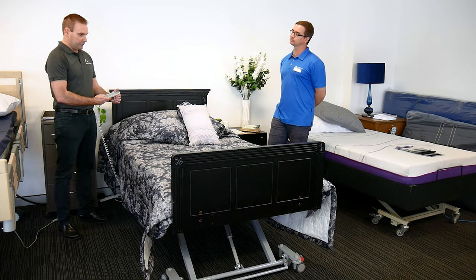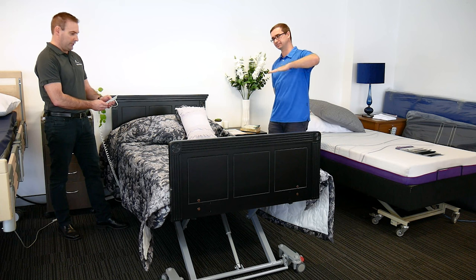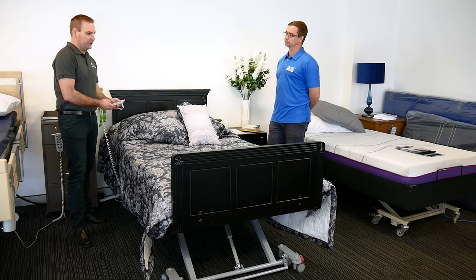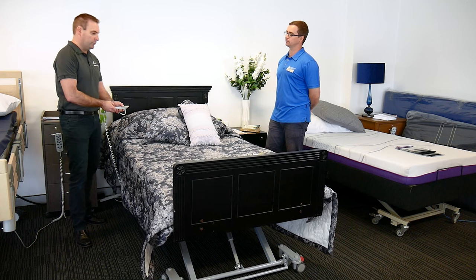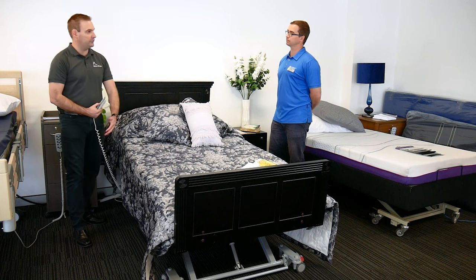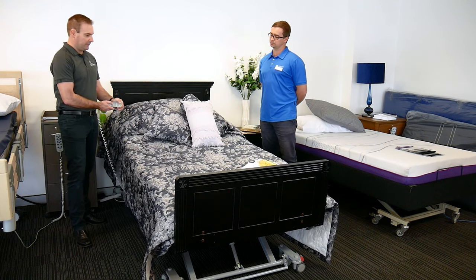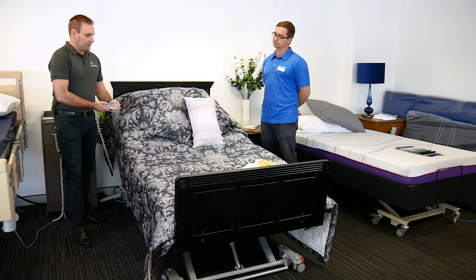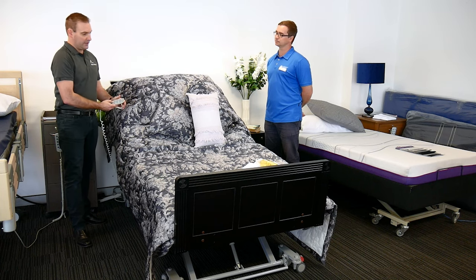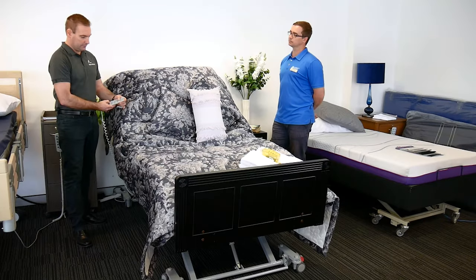It also has the Trendelenburg function. Trendelenburg means head down, feet up. Reverse Trendelenburg is feet down, head up. This is mainly used for specific clinical and medical conditions and not common for everyone. However, one thing it does help with is getting in and out of the bed, especially for those finding it difficult to get their legs in and out — it can help you get into more of a seated position when you raise the backrest up. So it can help with transfers as well.